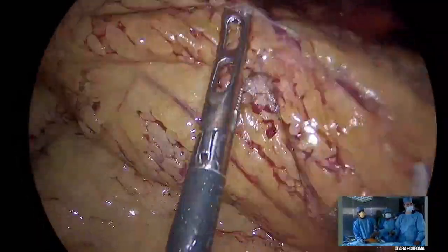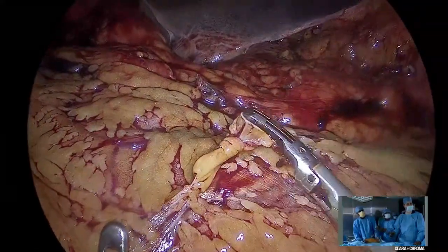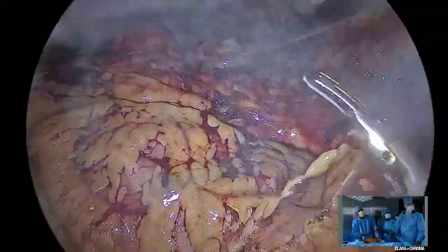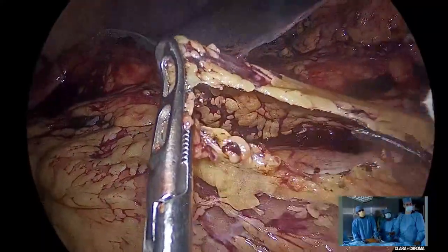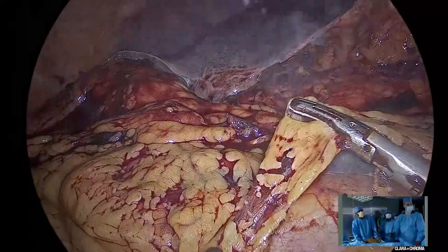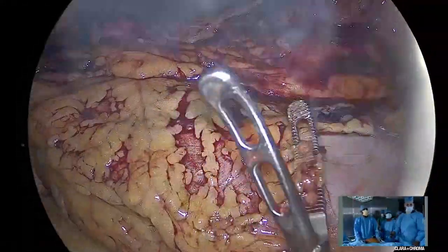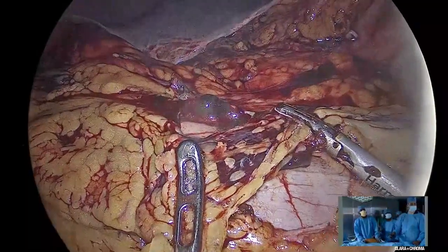You're absolutely right. But today I've been so worked up on, carried away by this upper abdominal adhesion. Yeah, I can understand that. So I thought we'll just finish off the difficult bits first. And so now Dr. Jameel is clearing the omentum over the transverse colon in preparation for dividing the colon at the site he has already decided.